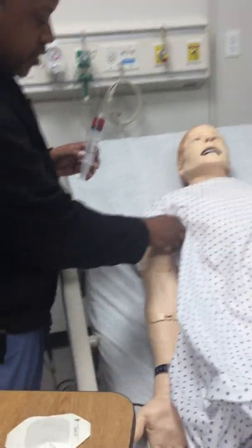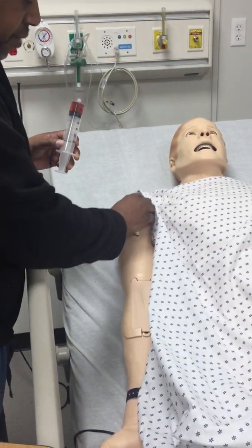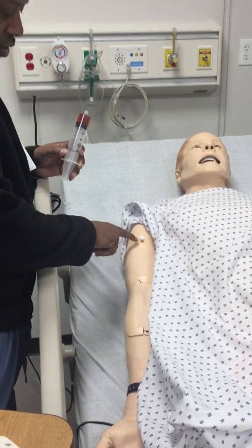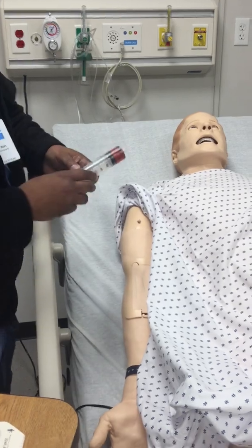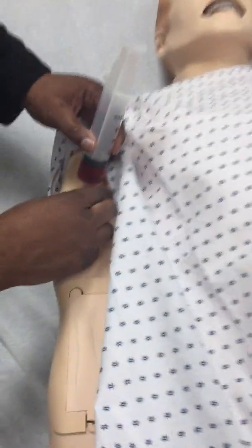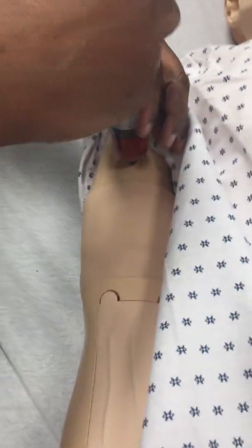We're going to do a brief tutorial regarding putting the IV in simulation mannequin essentials. This right here is the port that you put the blood in. We're going to put about 16 mls. Take a regular syringe and just screw it on.